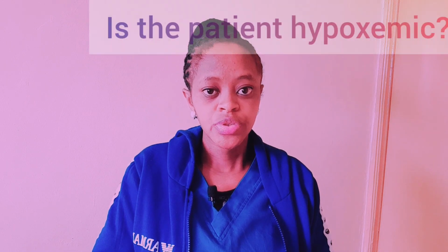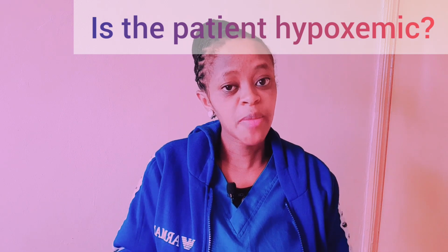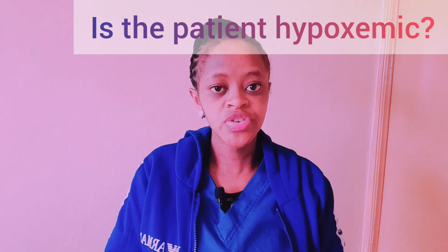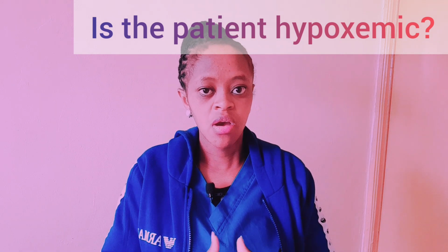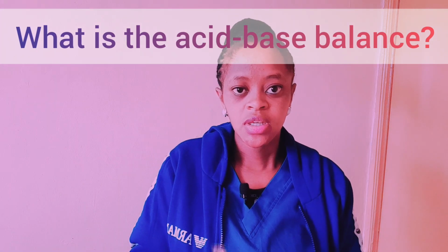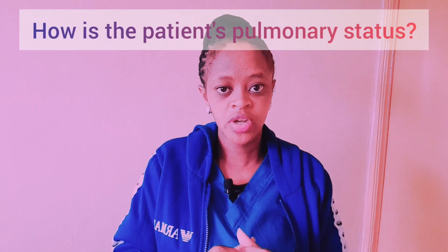You can follow this 5 steps approach to interpreting your patient's ABGs. Is the patient hypoxemic? Look at the arterial partial pressure oxygenation as well as the oxygen saturations of the patient. Secondly, what is the acid-base balance? Check the pH levels.